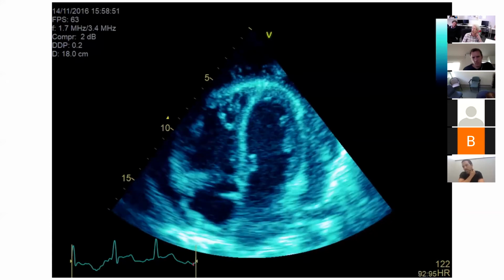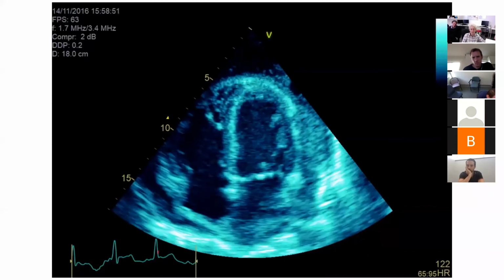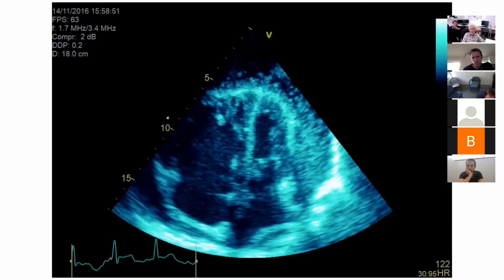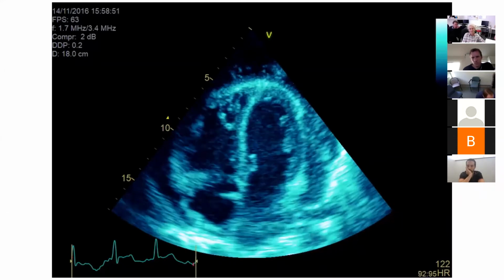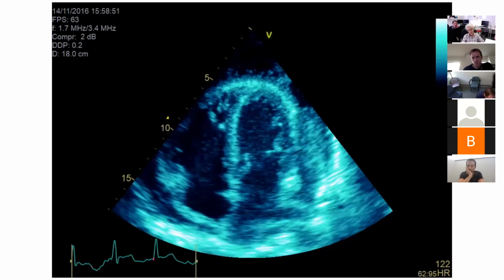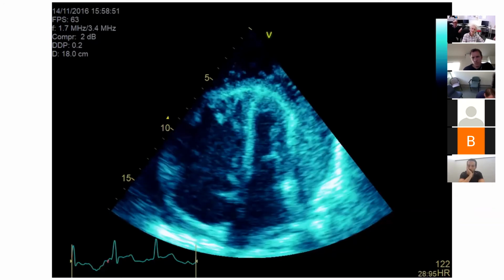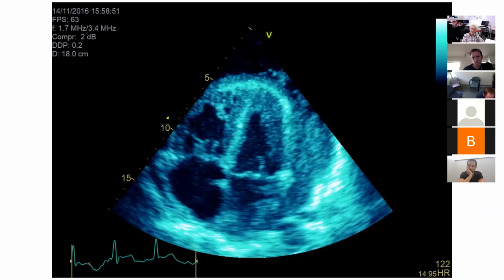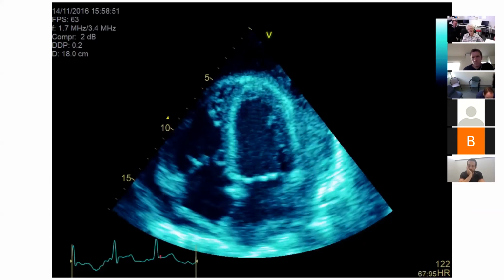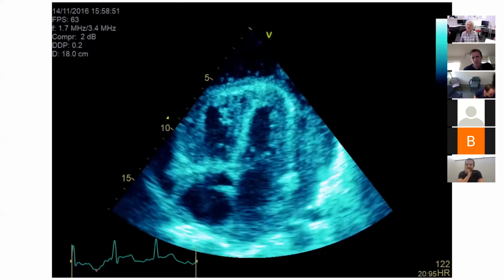Okay, any comment on that pericardial effusion? Very echogenic. Anteriorly maybe. It doesn't look that echogenic posteriorly. Okay. Have a look. What about next door to that LV? Is it coming out okay? Can you see it all looks speckled? It looks like small sort of foam bubbles coming through it. Can you see all that? Now that you've pointed it out. Yeah, nice. So okay, don't forget his history.